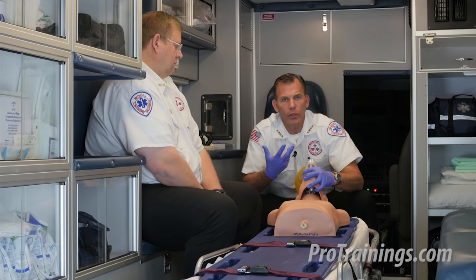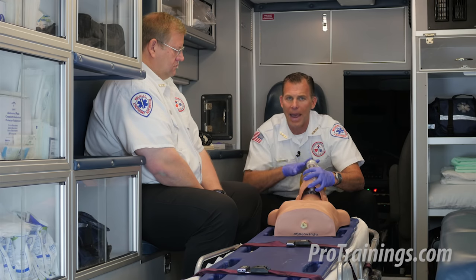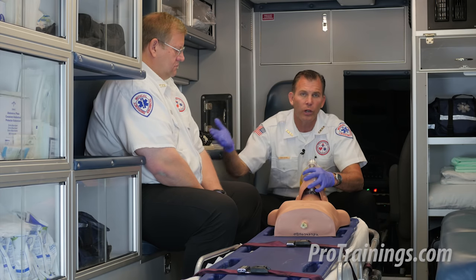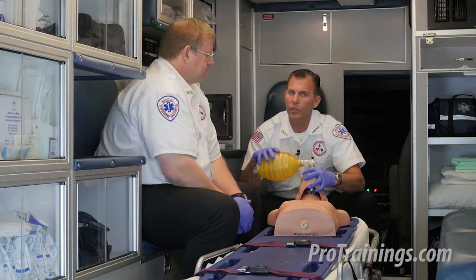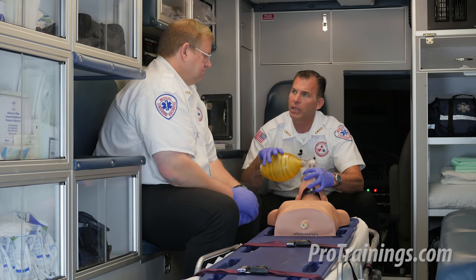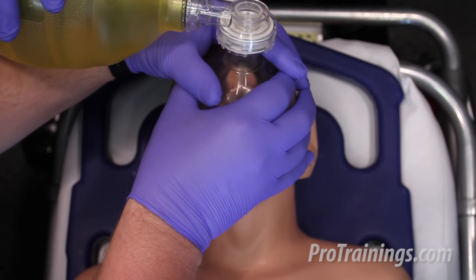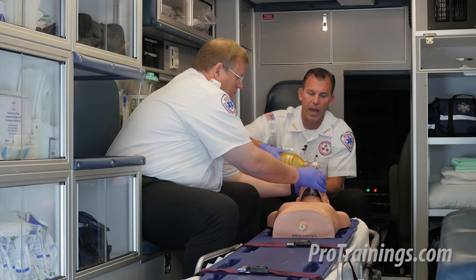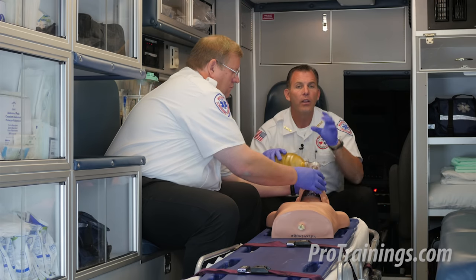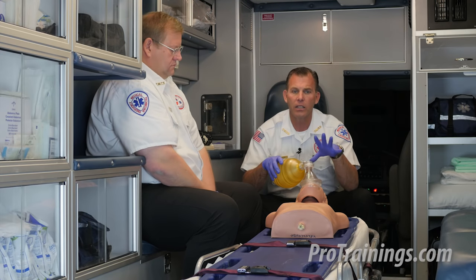However, there can be facial features — external, internal, or traumatic — that cause problems with sealing the mask. If we run into that situation and we have a second rescuer, we can always incorporate them. For example: 'Jody, I'm having a hard time getting a good seal here — could you seal that mask while I concentrate on squeezing the bag?' With two hands on the mask, when they say they've got it, I'm going to squeeze the bag and I should see chest rise and fall. If I do not see a chest rise and fall, that air did not go in. No matter how bad I want it to — no chest rise, no chest fall — we did not give the patient a breath.